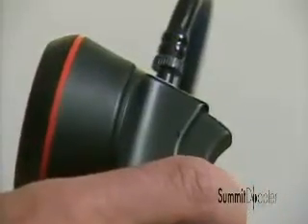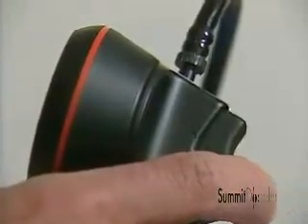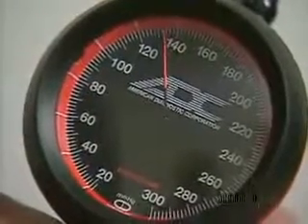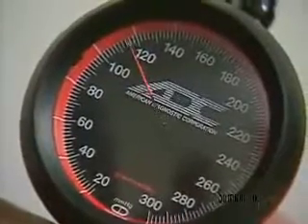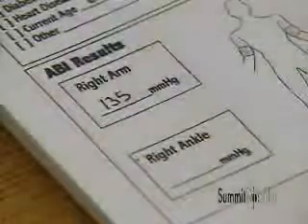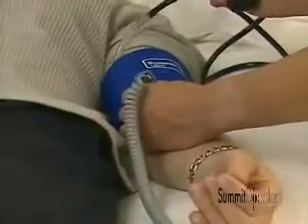Squeeze the inflator's trigger gently to deflate the cuff at a rate of approximately 2 to 3 millimeters of mercury per second. Note the point at which the first blood flow sounds return. This is the systolic pressure. Afterward, deflate the cuff fully. Record the pressure on the report form and then repeat this procedure on the left arm.